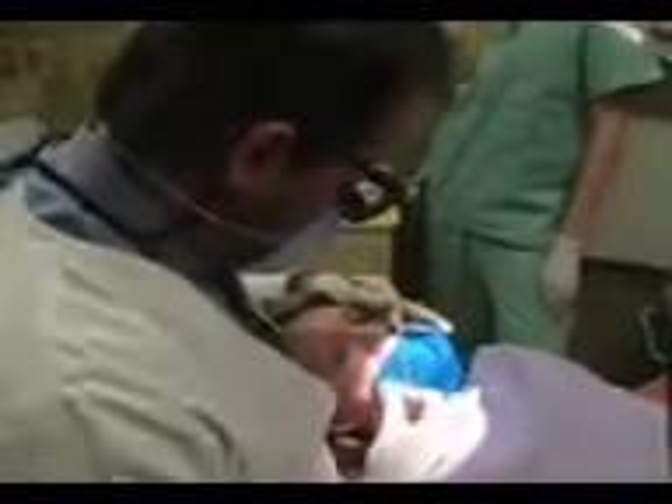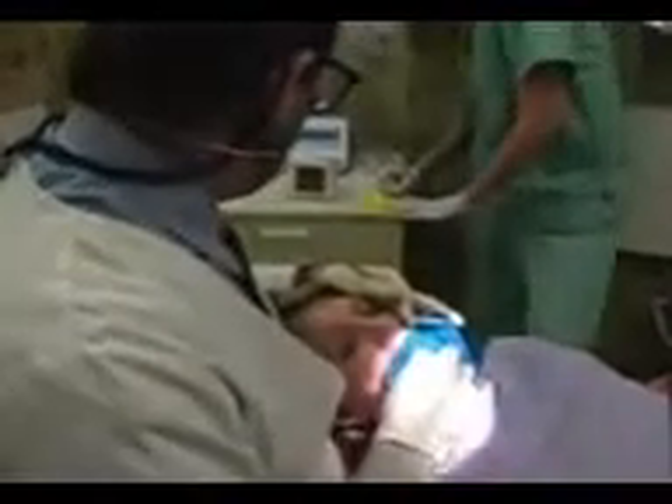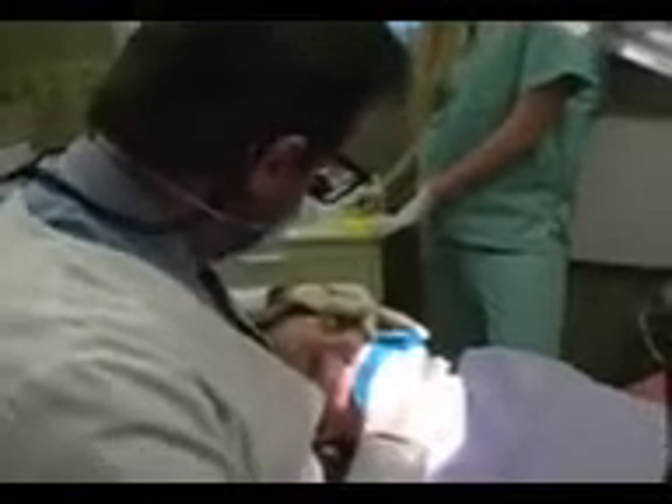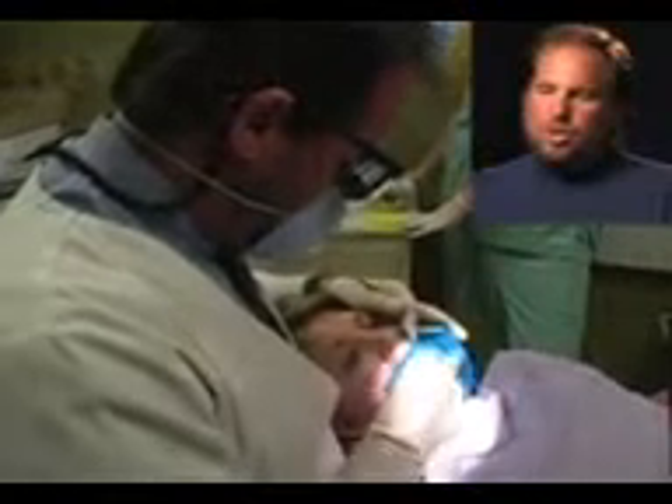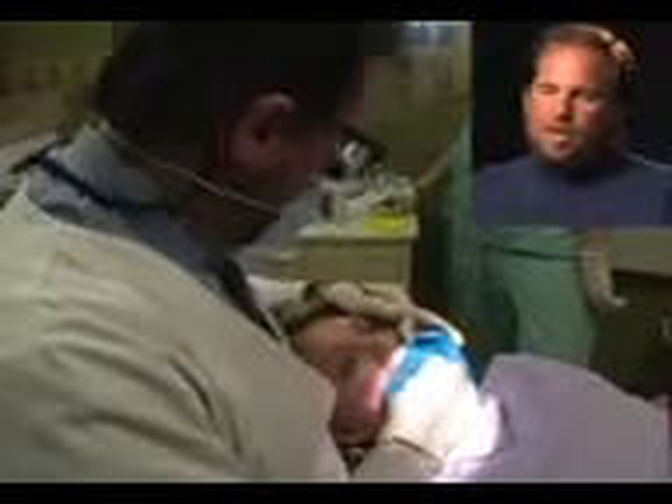I'm looking at the apex locator now to verify the root length. My assistant Joelle is recording those measurements. You need to know how long the tooth roots are to completely remove all the infected tissue, and when you ultimately fill the root canal you need to know how far to place the filling, because you can't see underneath the jaw. That's why you need these machines.